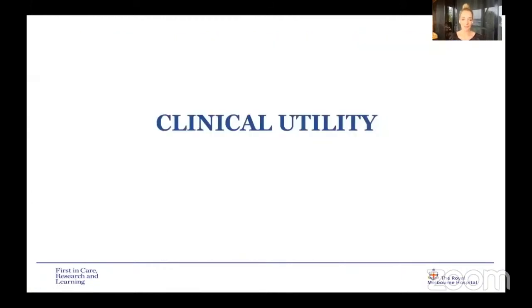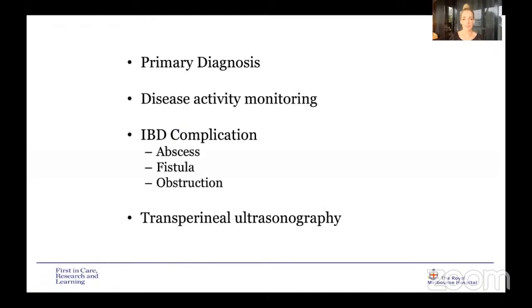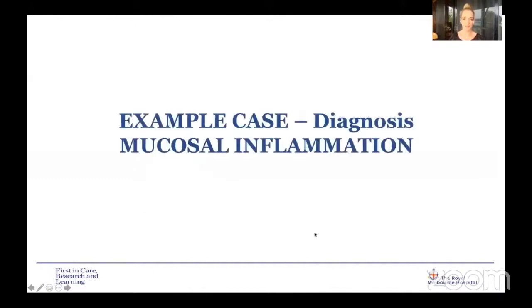So in terms of the clinical utility of intestinal ultrasound, once you start using this technique, you can't imagine doing any clinical practice without it, because it really does transform your care. There are multiple ways it can be used. It can be used for primary diagnosis, disease activity monitoring, and assessing for inflammatory bowel disease complications, including abscess, fistulas or obstructions and strictures, as well as transperineal ultrasonography to analyse perianal disease, but we won't be going through that today because of time limitations. So this is just an example case of how we can diagnose mucosal inflammation.